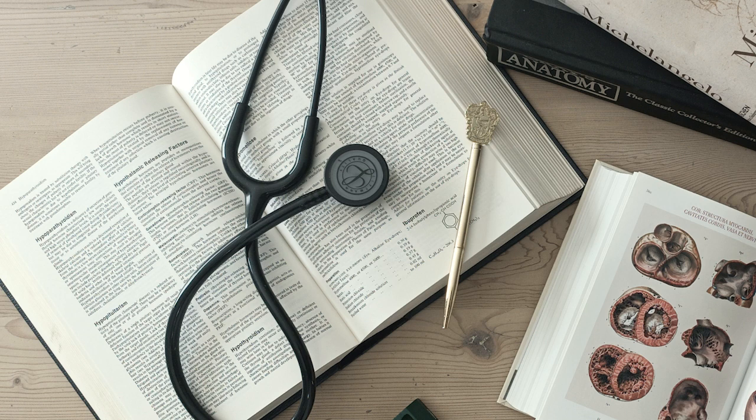Rule number 1. This is critical. Do not be immediately distracted by large abnormal waves on the ECG. Resist the urge. Exactly. Your eyes will naturally be drawn to them, especially a wide, bizarre QRS complex, but resist that urge initially. Focus on the fundamental smaller components first. So we start small then with the P waves. That sounds counterintuitive when you see a wildly abnormal QRS. It is counterintuitive, but it's the key to consistent diagnosis.